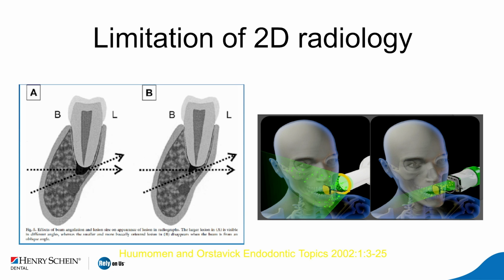Those are the two major indications for intraoral radiograph. But other than that, more and more indications are coming with the CBCT small field of view, and I'll go over a few of those. If we think endo, for example, the American Association of Oral and Maxillofacial Radiologists and the American Association of Endodontists published a guideline, and I will make that information available on my Facebook page.